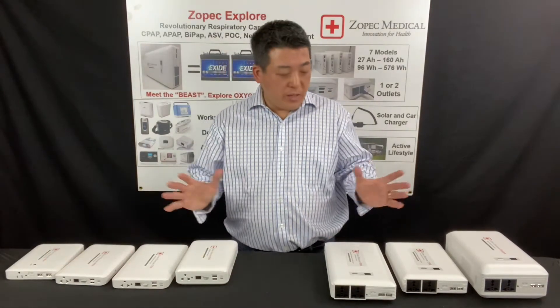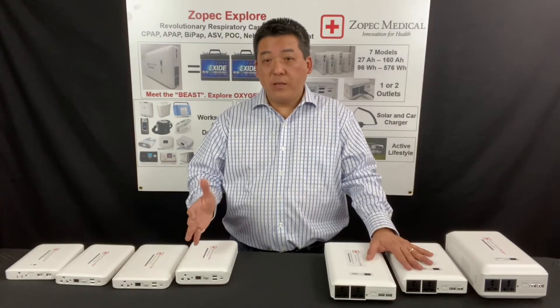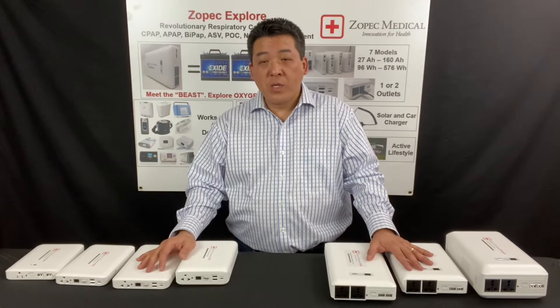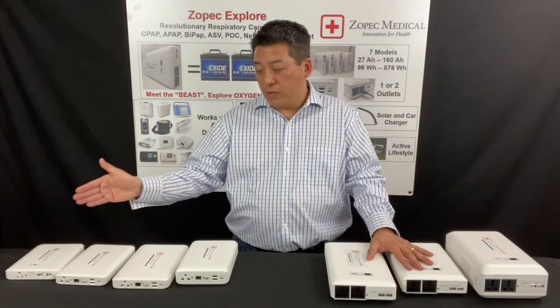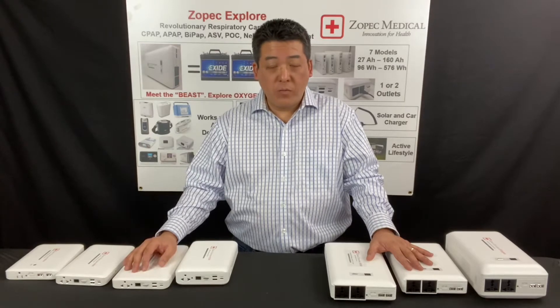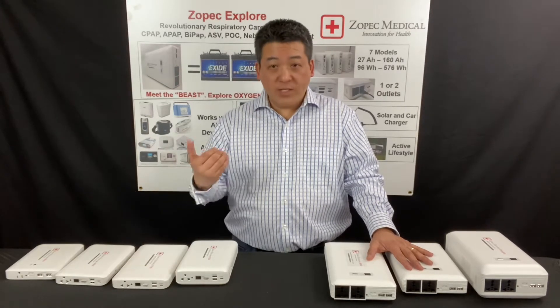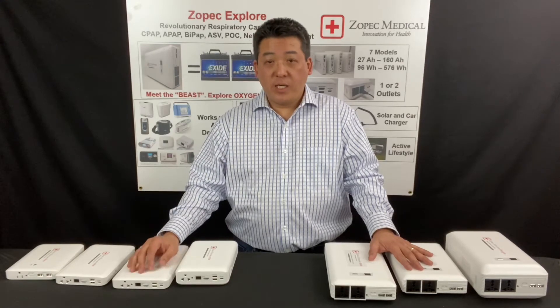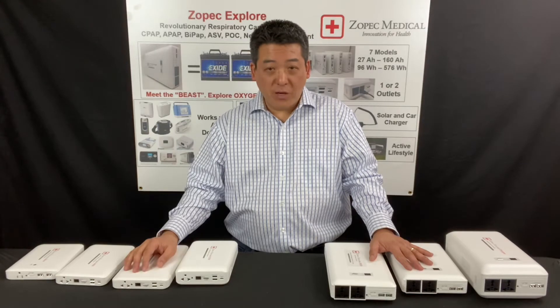There are multiple models within each series, and that's just because they have different capacities. So depending on how much runtime you need, you will choose the right model for you. We have a runtime table on our website so you can take a look at how much runtime you need and select the model for you.